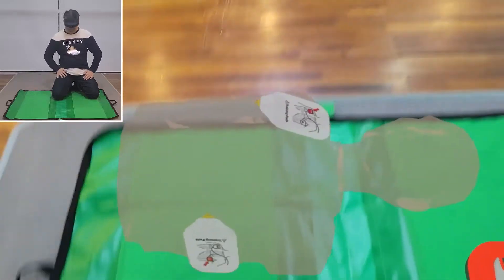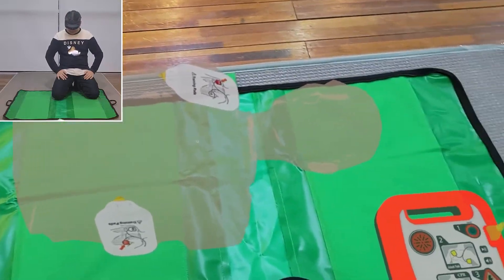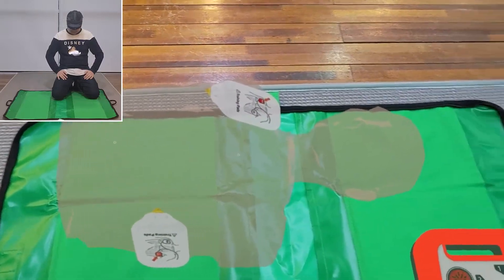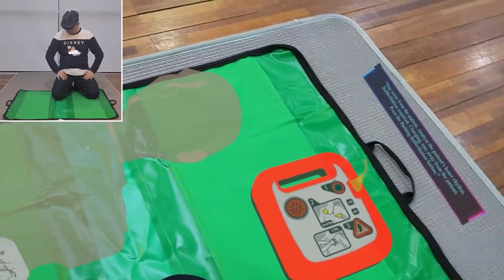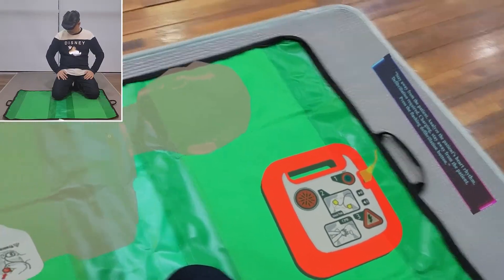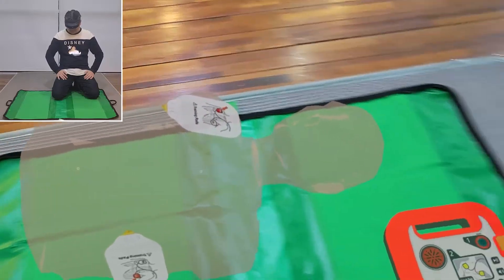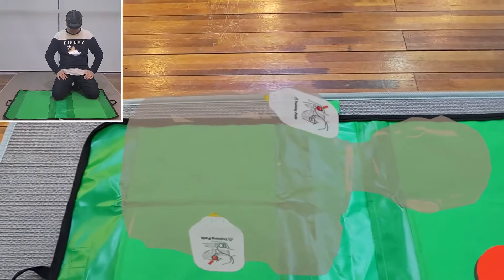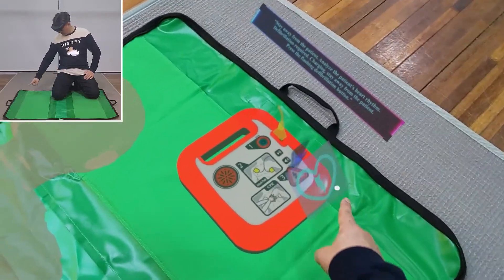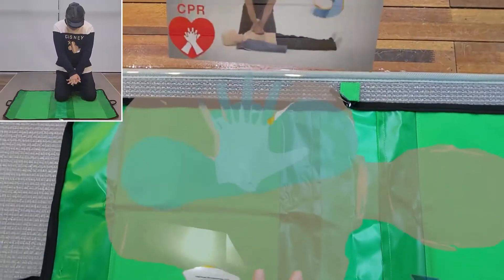Stay away from the patient. Analyze the patient's heart rhythm. Defibrillation required — charging. Stay away from the patient. Press the flashing defibrillation button. Defibrillation is done.